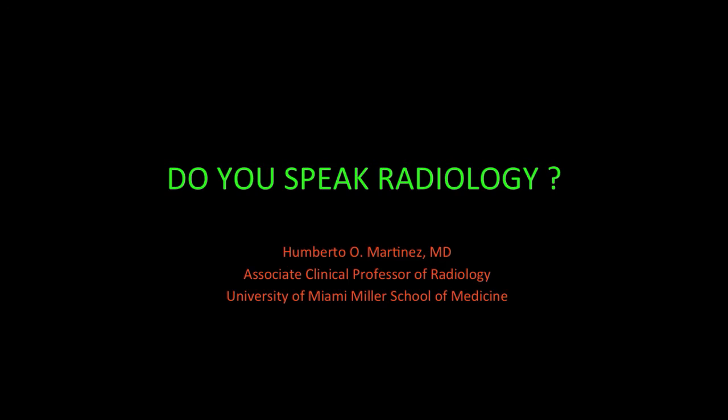Many students appear to be confused about how to describe the findings in different imaging modalities in radiology. So essentially I thought, well, do you speak radiology? Hopefully this short video will help and clarify this situation. Each imaging modality has its own language, its own lingo. So let's review who they are.